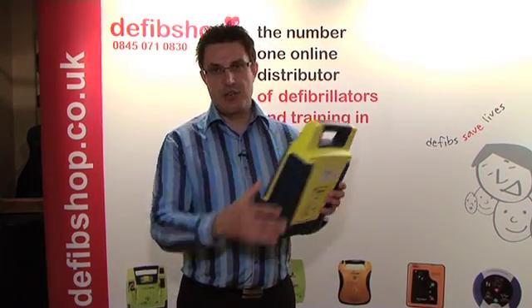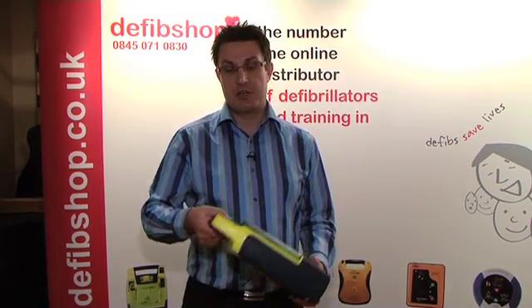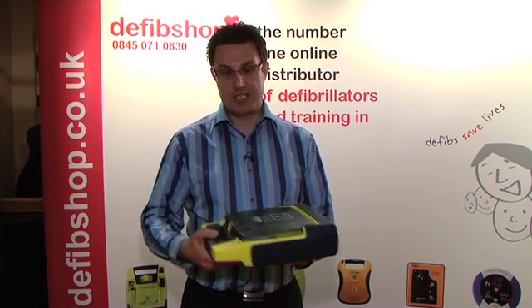You can see that the unit is robust — it's quite a sturdy unit. It's got its own carry handle, and to switch the unit on all you need to do is simply open the lid. On this occasion we will be demonstrating the Cardiac Science Power Heart G3 Plus fully automatic version.